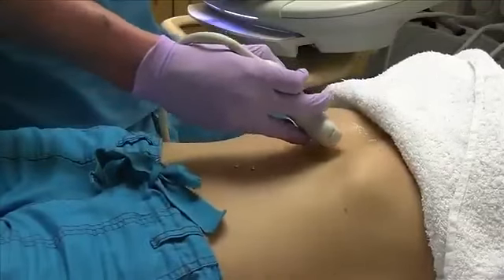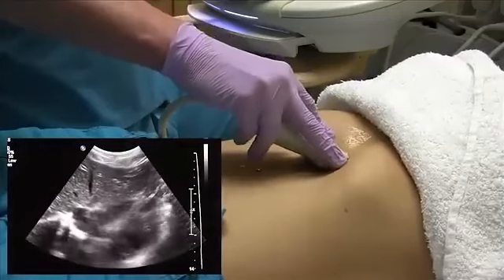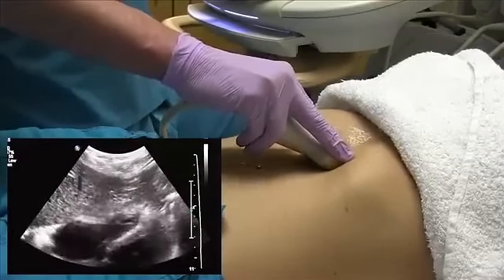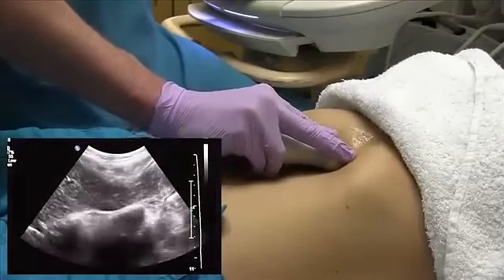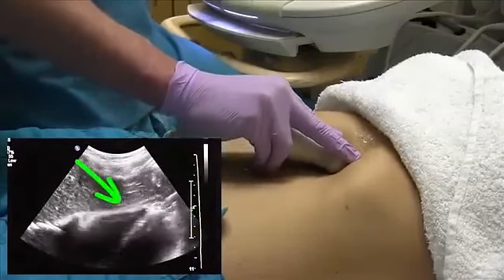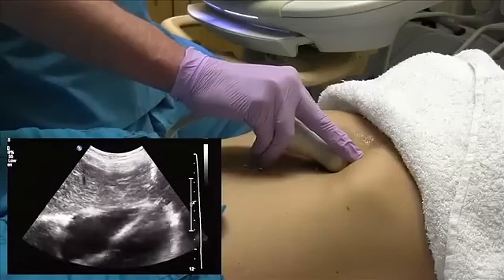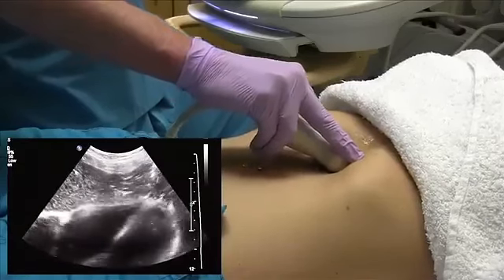Next we go transverse, and for that we're going to start again with the left lobe, subxiphoid, and you kind of grab the top of the probe here, and you want to make sure you sweep all the way up through the left lobe till you see the heart. And then as you come down, very similar protocol, you start at the top of the left lobe with the parenchyma.